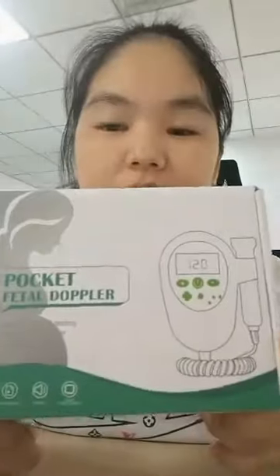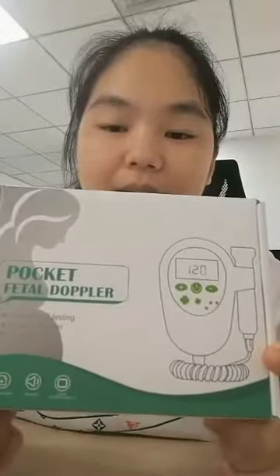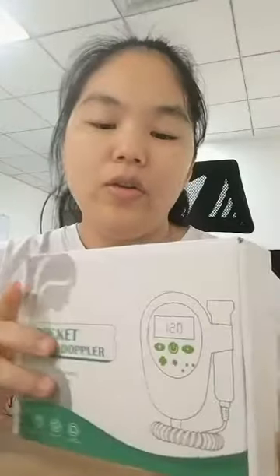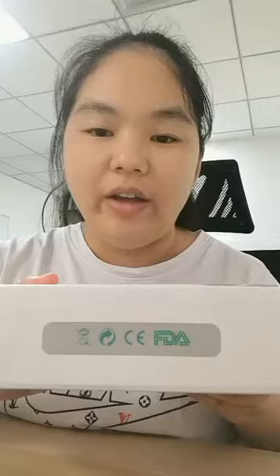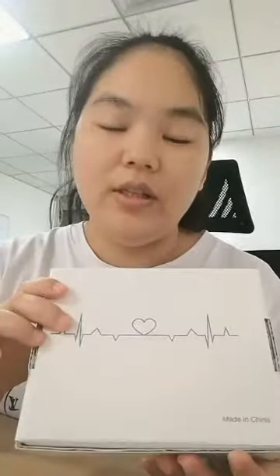Today I will introduce our new Europe Designs patent, Vettel Doppler. This is a new arrival and we are applying for FDA certificate now and looking for distributors in every country.